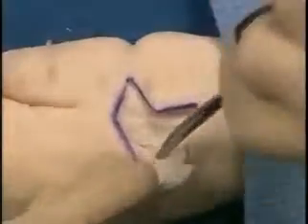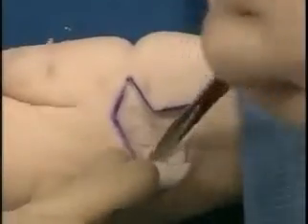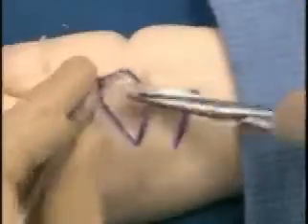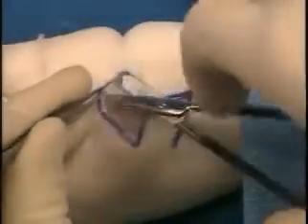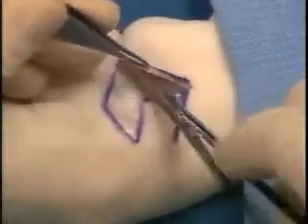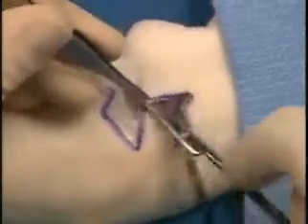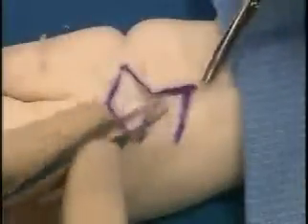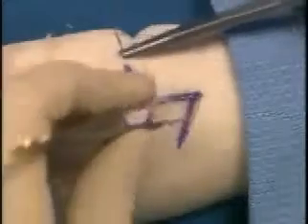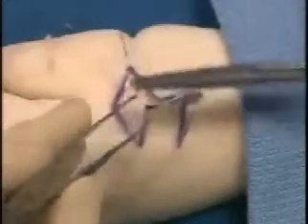Be sure to widely undermine this tissue, and again the tissue may be undermined using scissors or a 15 blade. You want it widely undermined so that the flap will be rotated into position so that it is not under any extreme tension. Notice the wide undermining in this particular case. Once the flap and adjacent tissues are widely undermined, then the flap is rotated into position.